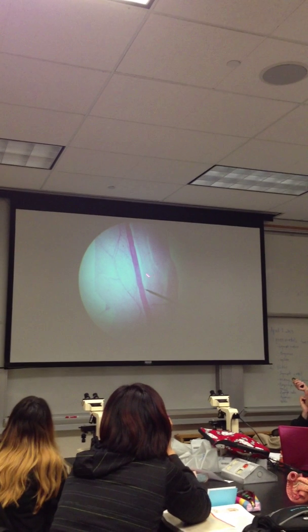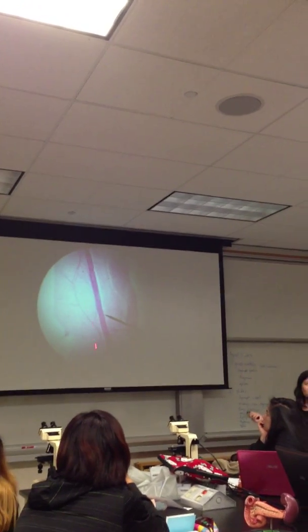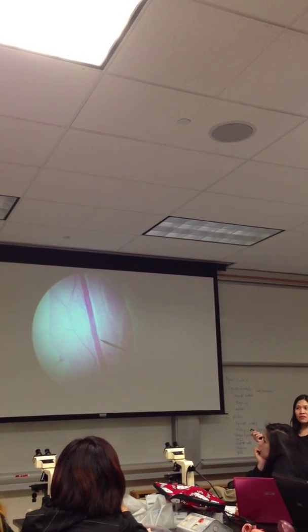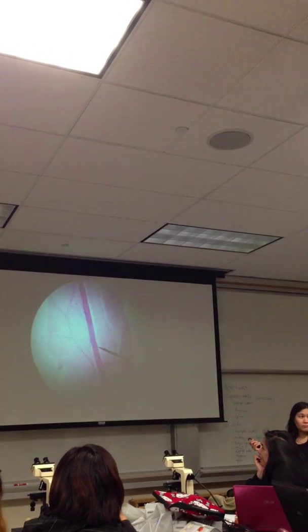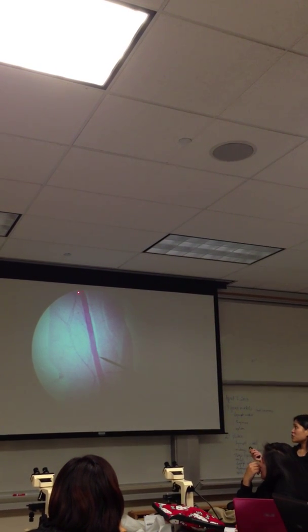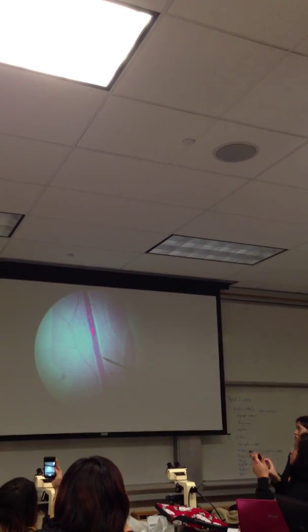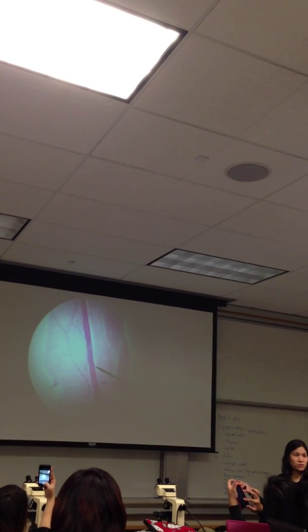Okay. Well, they're all around. Okay. So, what is this? Lymph vessel. It's a lymphatic vessel, right? Do you see the characteristic valve, the V-shaped valve? Okay. Now, this is very distinct because it's like a tube-like structure, right?